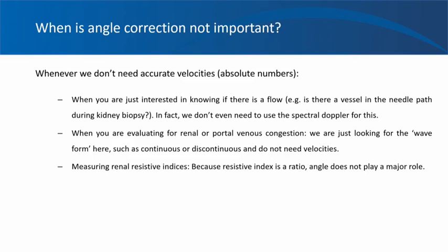So when is angle correction not important? Good news is that for most of the point of care ultrasound applications we perform, angle correction is not important. Angle correction is not required when your evaluation is not dependent on the absolute numbers of the velocities, but you're more dealing with the ratios or just the flow patterns.